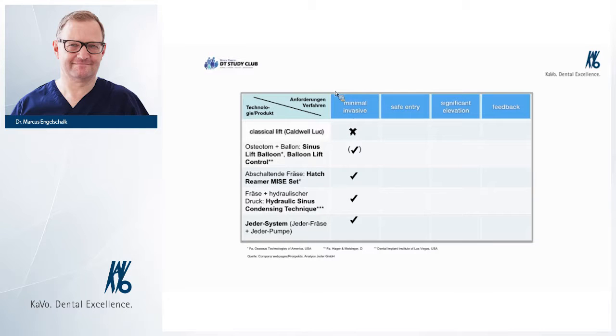It's not important to elevate the sinus floor and to bring the implant in at the same time if it's not possible, because this depends on the residual bone height as we discussed already. This is given by the anatomy of the patient or the defect of the patient. But if you perform sinus floor elevation, it's very, very important to be less invasive for the patient. Well, just to give you an overview with pictures of what I mentioned on the slide before.